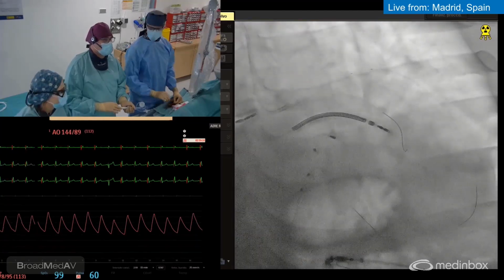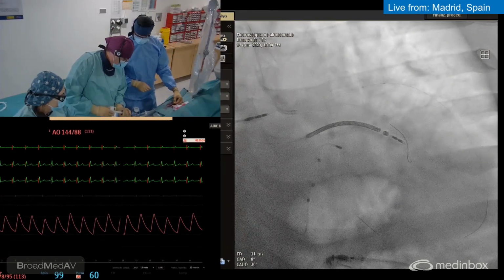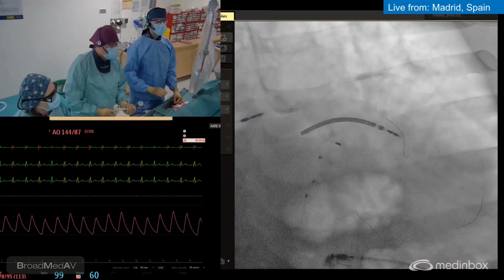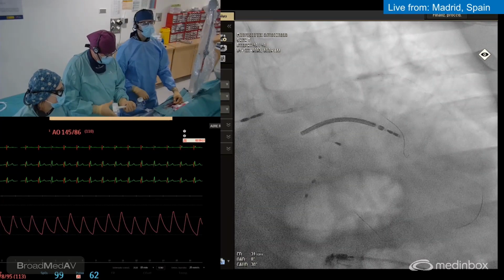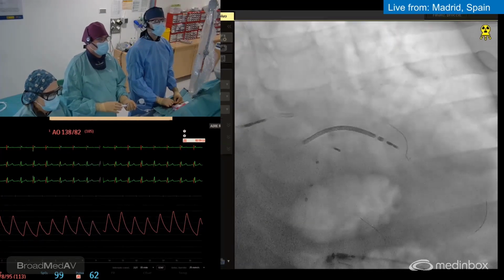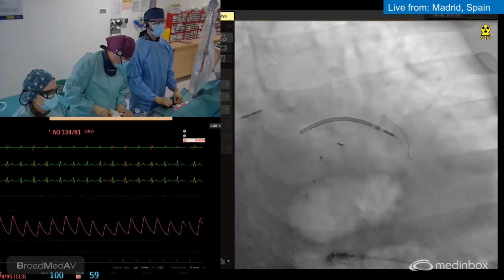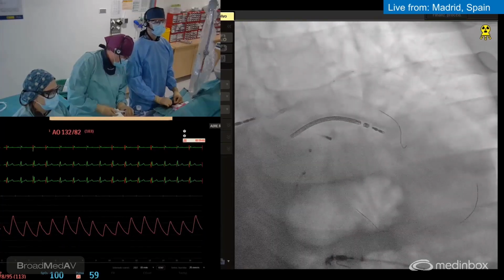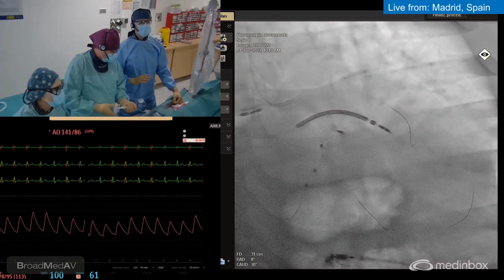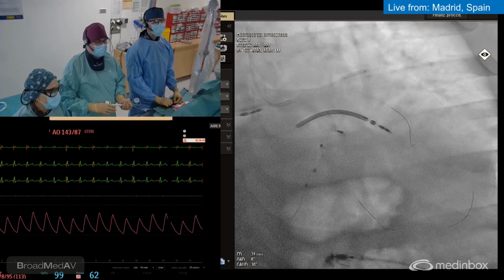we're also trying to reduce the radiation. You know, with obese patients, this is going to be double that of a non-obese patient. Okay. 18. 18, perfect. We're going to store the fluoro. Is there any question, Danny, from the audience, or... It's too early? Yeah, it's too early. There are no questions. Okay, the expansion seems quite good. 20. We're going to check IVUS again later on, so I'm going to save some fluoros and some cines.